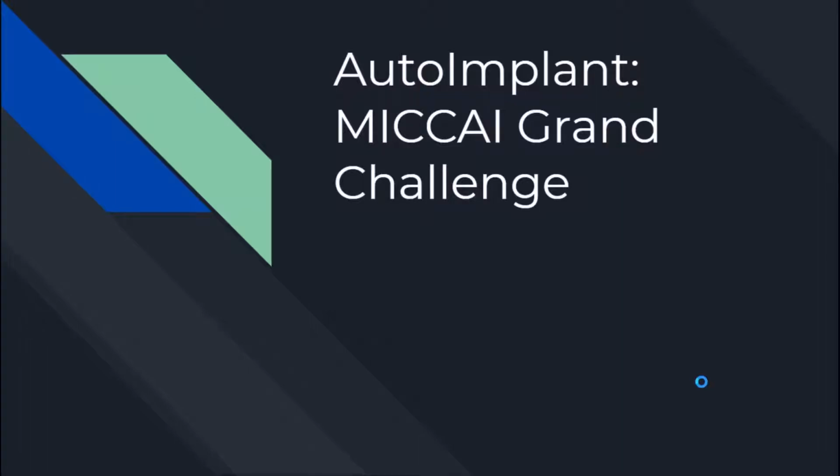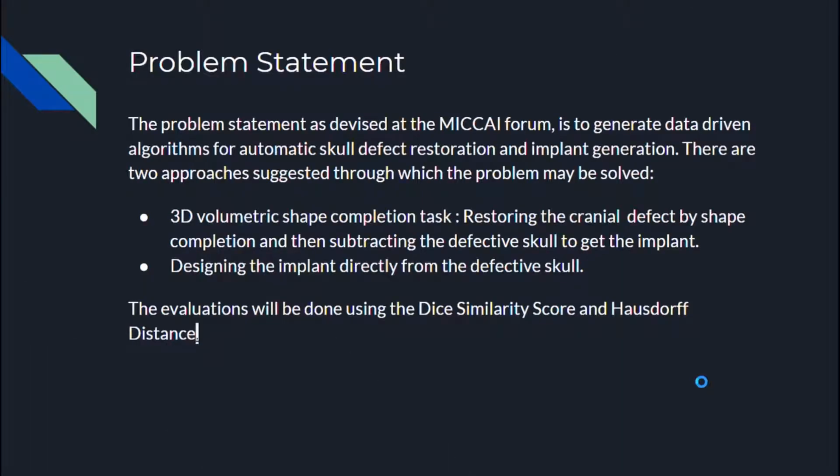Moving on, the first thing that we have is the problem statement for the AutoImplant challenge as devised by MICCAI. Our task is to generate data-driven algorithms for automatic skull defect restoration and implant generation. Basically, our aim is to generate a cranial implant for a defective skull.